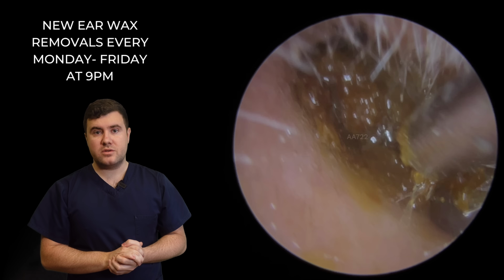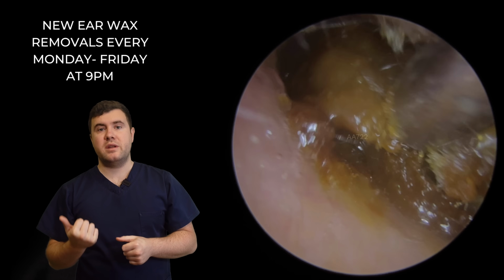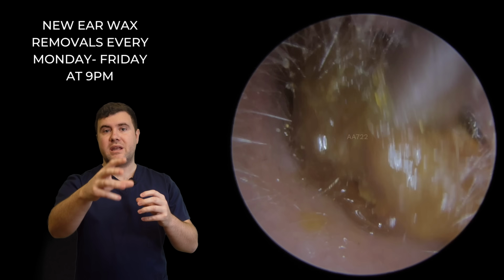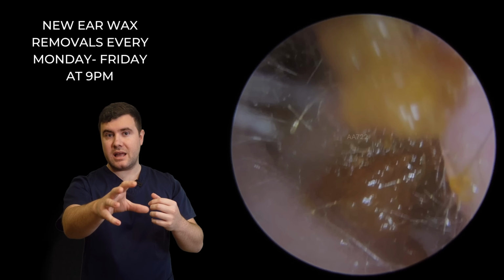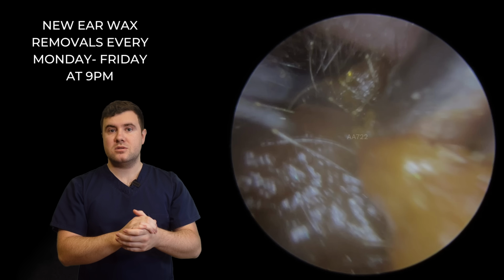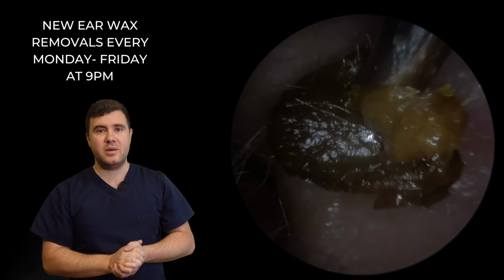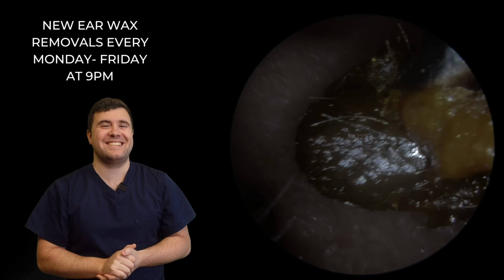Little bit of olive oil introduced here now. So again, similar to what we've already mentioned, the oil is not going to soften anything straight away, but what it can do is actually lubricate the ear canal and allow us to slide this wax out a lot easier. So Rhys has got a bit of a wiggle going on here. We got a good grip there now. It's quite a big piece actually. It's quite a big nugget of wax that's come out there.